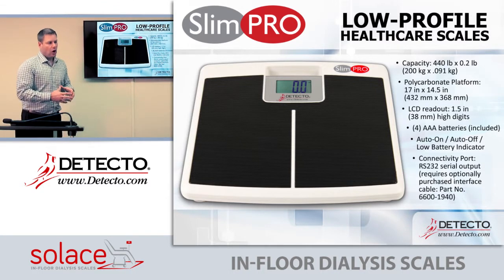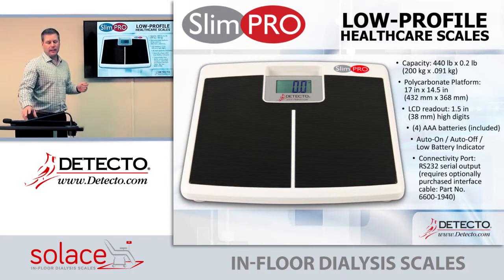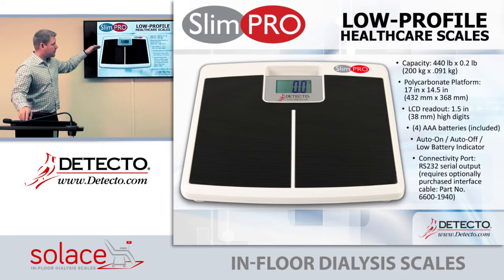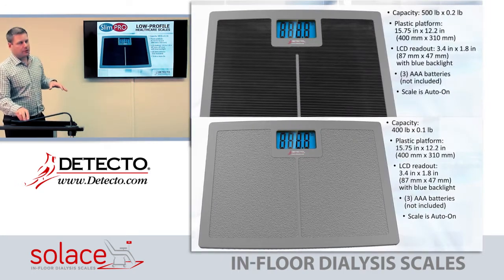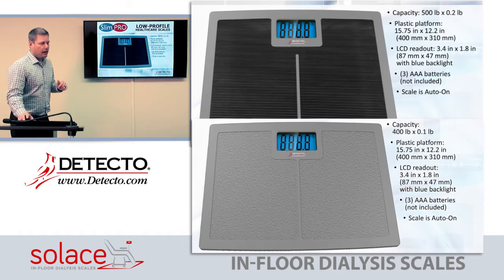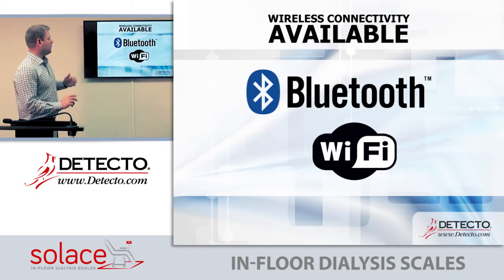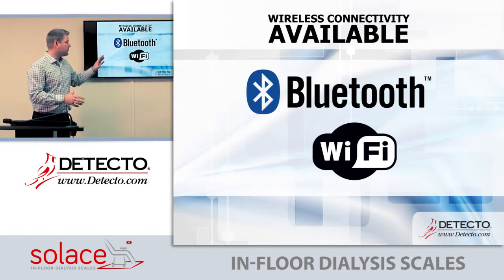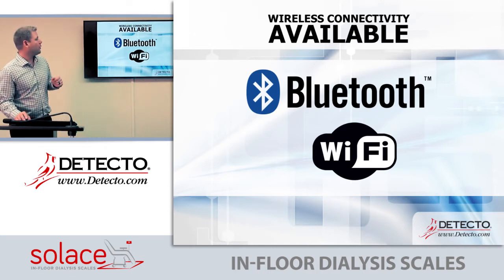Dialysis centers typically send patients home with a bathroom scale, and they move large quantities of them through their clinics. We have the Slim Pro, which has been around for several years, has some connectivity, and a 440-pound capacity — a good scale to send home with patients. We also have other options we can private label or sell as more basic standard scales with 500-pound capacities. Bluetooth and Wi-Fi are available on most models shown, including the Apex, Icon, Solus, and 6055.